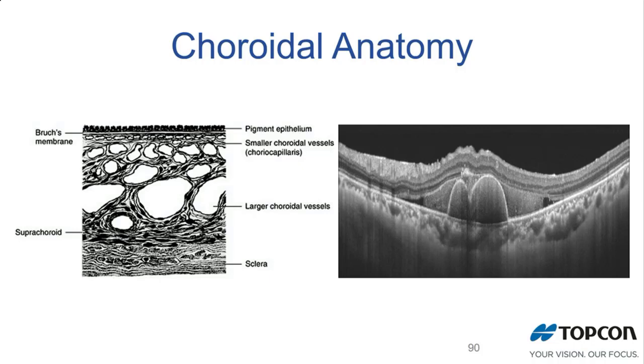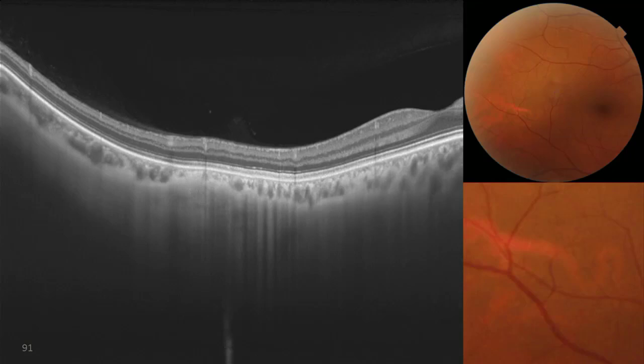So we want to look at the choroid though. So how do we do that? What I figured out is that you can use a weird artifact in structural OCT. What is the striking difference between the intraretinal vessels and the intrachoroidal vessels? What jumps out at you right away? These vessels, even though they're the same size as these, are black with a white shadow. These are white with a black shadow.